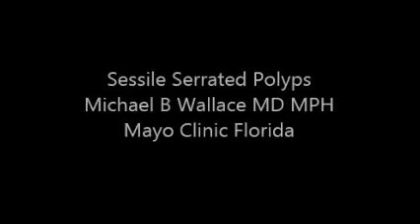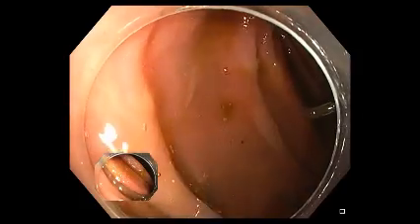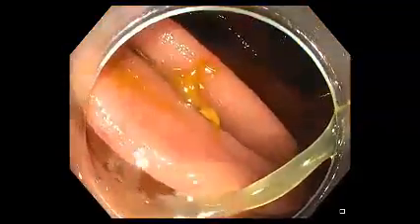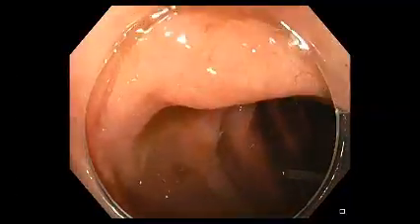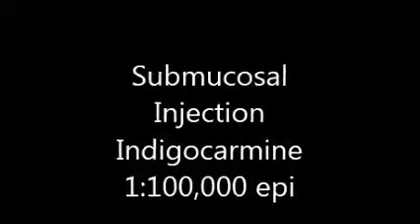The following video demonstrates methods for detecting and removal of sessile serrated polyps. In this example we see a polyp arising in the upper left corner of the screen with characteristic features of a sessile serrated polyp. It's often indistinct with a cloud-like surface pattern with subtle serpiginous small mucosal vessels.